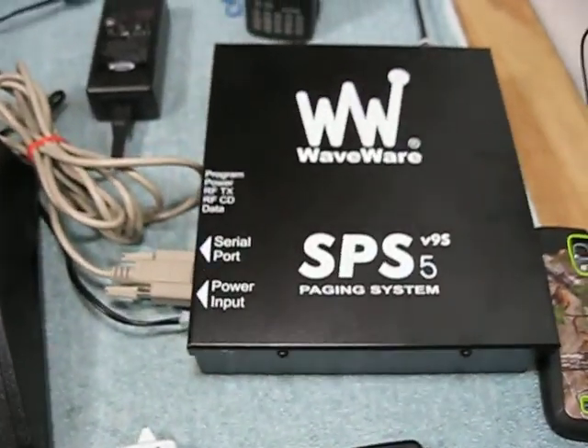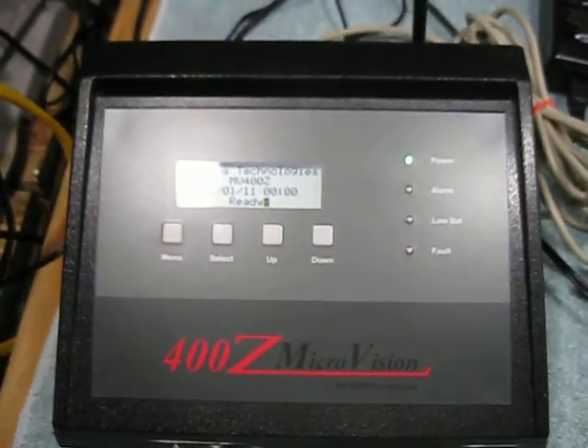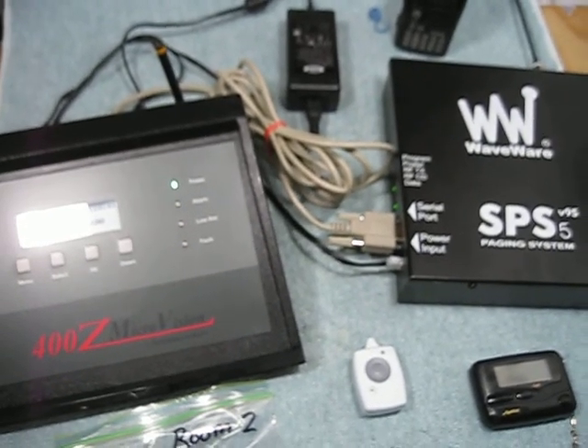Today is a demo of a WaveWare POCSAG transmitter and a nurse call unit. This is a paging system that would be used at an assisted living facility, small hospital, or rehab center.